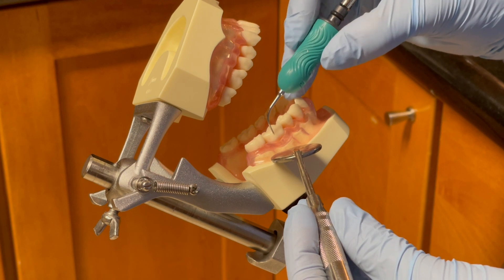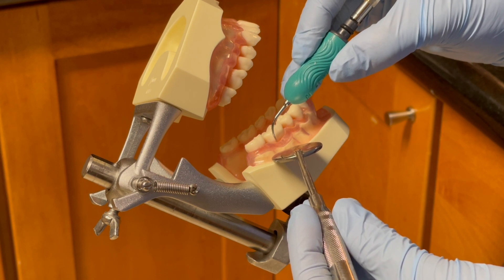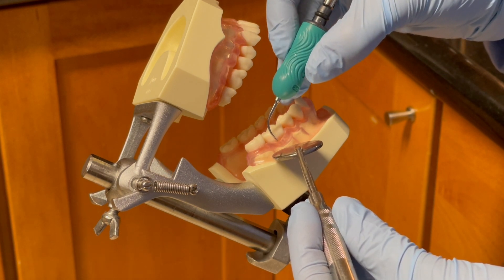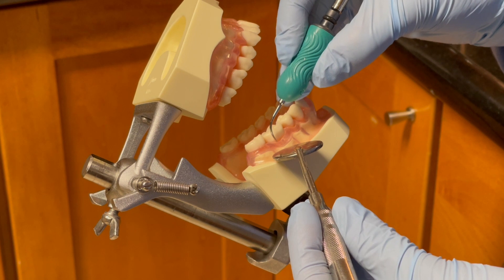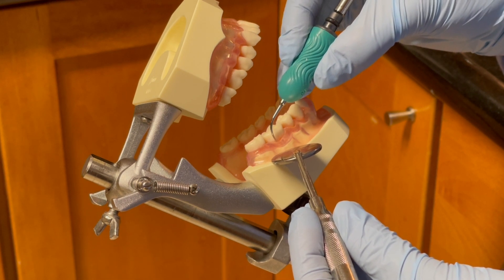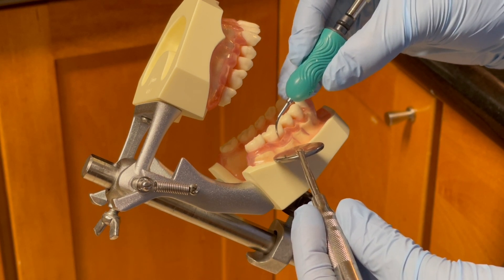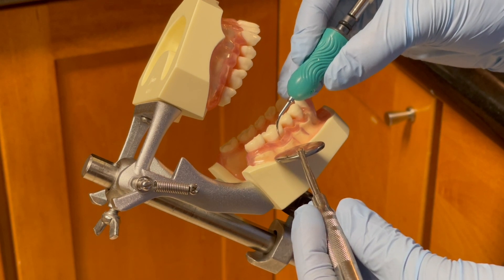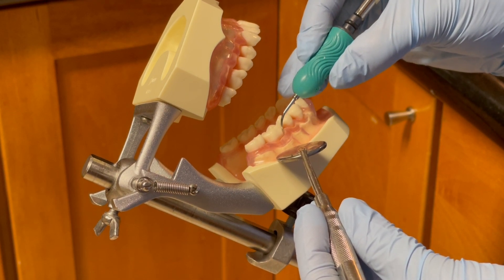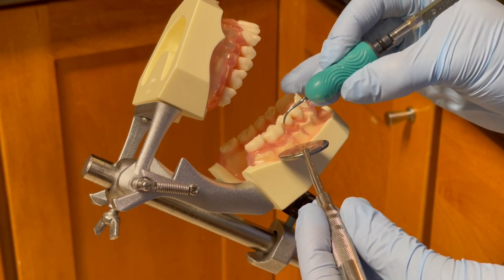I then insert the tip at the distal buccal line angle again with vertical orientation, adapting the 2 to 3 mm of the lateral surface of the working tip to the tooth surface, and use constant, well-controlled small 1 to 2 mm overlapping strokes, moving from the top to the bottom, covering all surfaces of the tooth in a systematic manner. I work the tip from the distal buccal line angle toward the mesial interproximal.